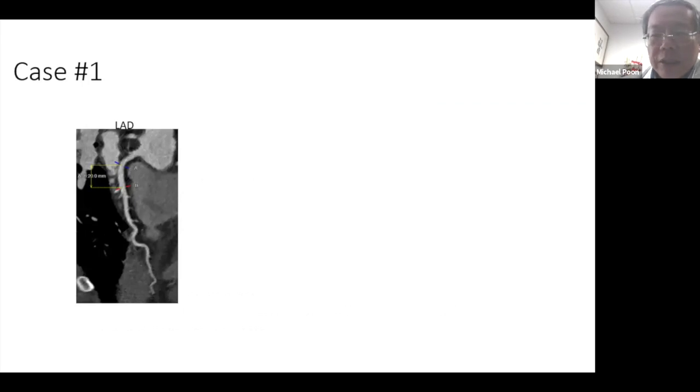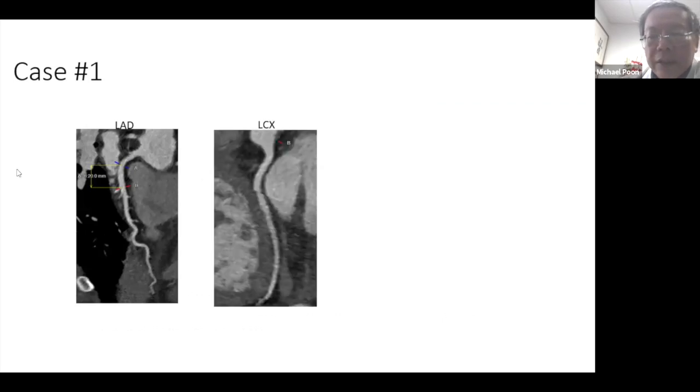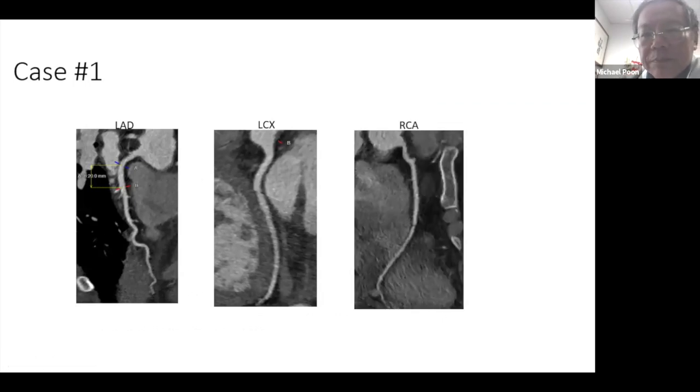So I just want to show you some of the images that we are currently using the CAT scan to look at the blood vessel. This is a patient who had chest pain, and we were concerned that this patient has blockages. When we did the scan and looked at the blood vessel using the technology that I talked about and artificial intelligence, we were able to see that the blood vessel is very, very healthy, and there's no plaque at all in all three of the main arteries to the heart. So this is good news, and nothing to do, and just continue a healthy lifestyle, and you'll be fine.